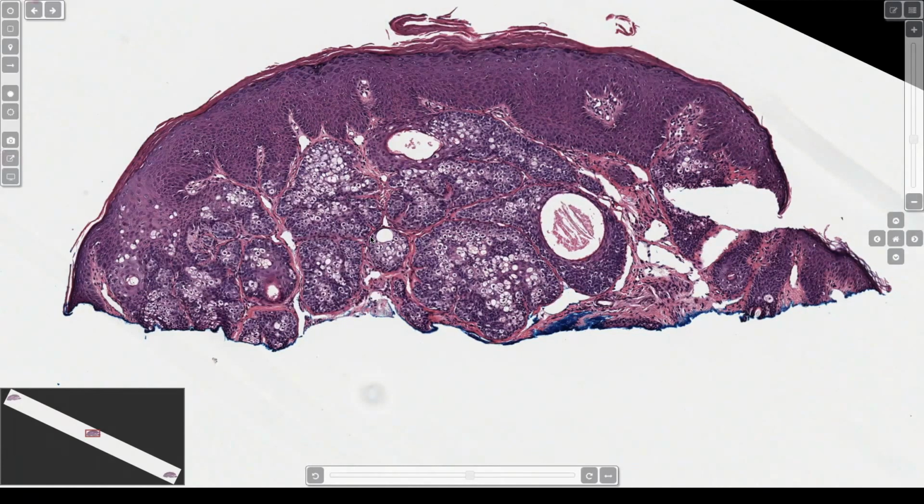The problem is that mitoses are often found. And I was giving a lecture one time and I couldn't find a single sebaceous adenoma in my entire collection, which is pretty extensive, that didn't have a mitosis. And that, to me, either means I misdiagnosed a ton of sebaceous carcinomas, which I think is probably not the case because no one yet has come and said that, or it's just that mitoses are there. So don't get freaked out by a few mitoses in these. And the basaloid cells, they look blue and basaloid. That's normal, right? That's what normal sebaceous glands have. So it can be a little hard to tell how much atypia is enough.